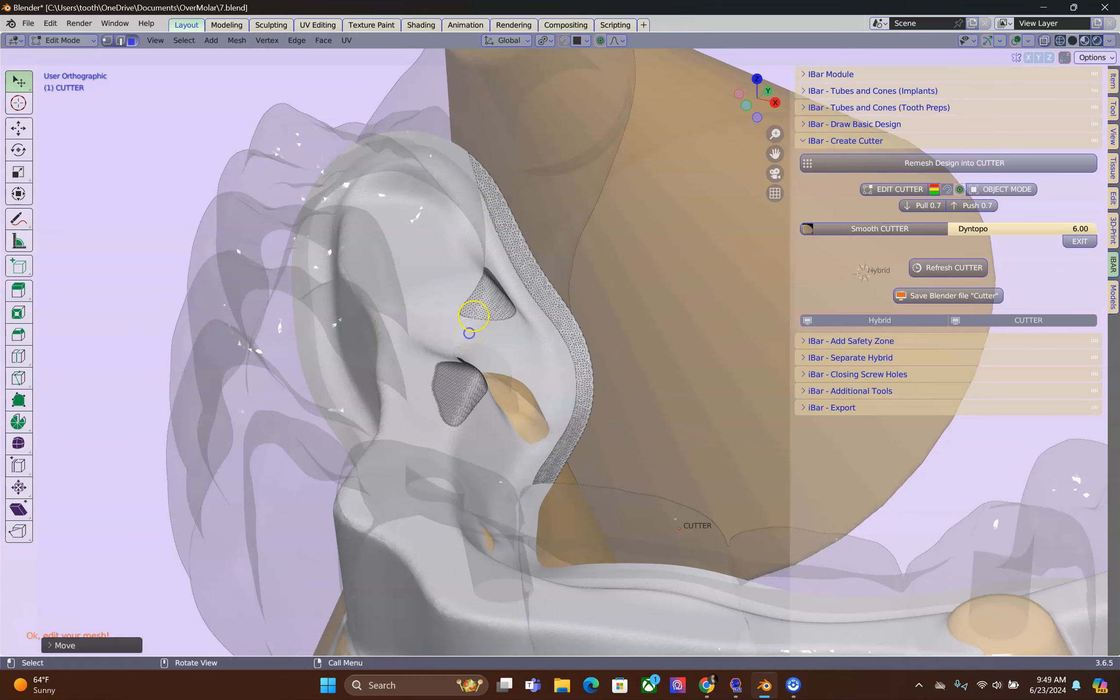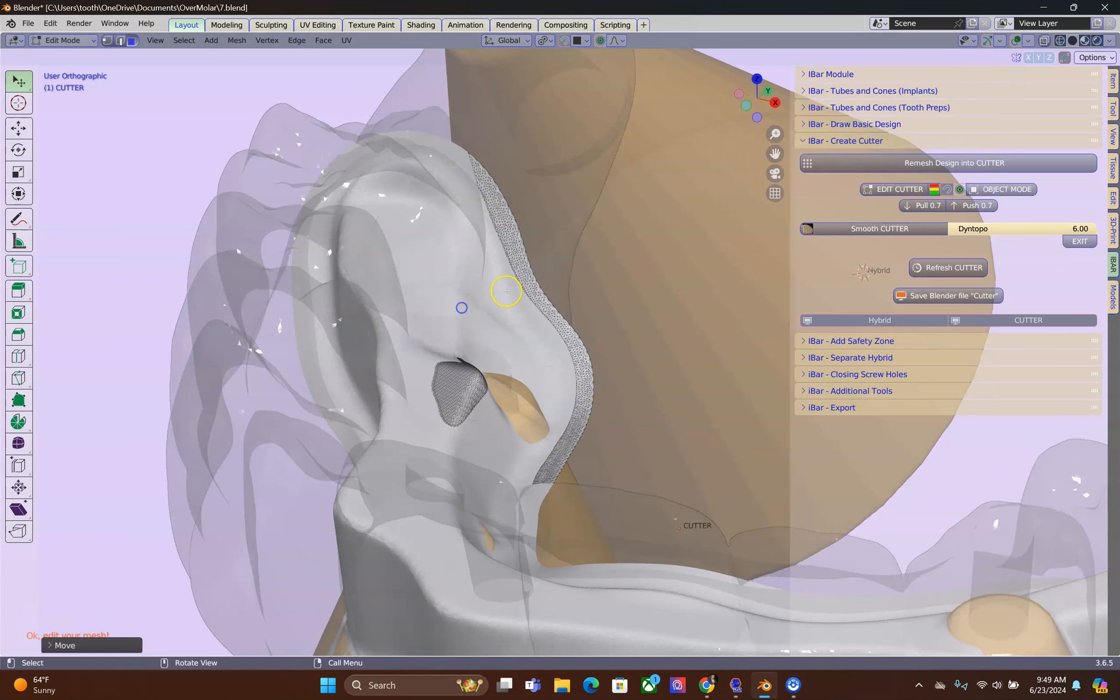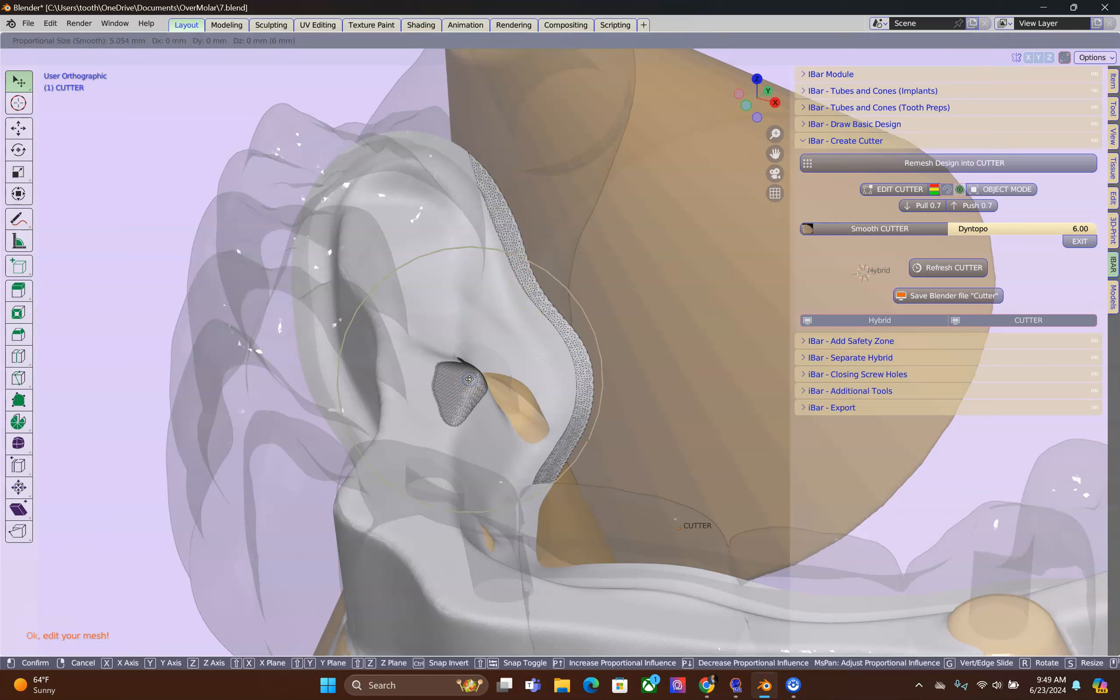Please make sure that your perimeter of your cutting tool still remains outside of the hybrid.